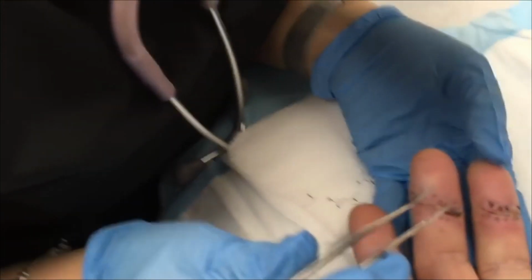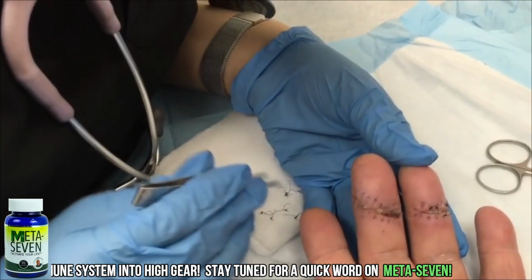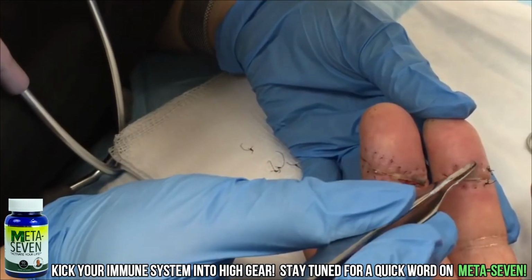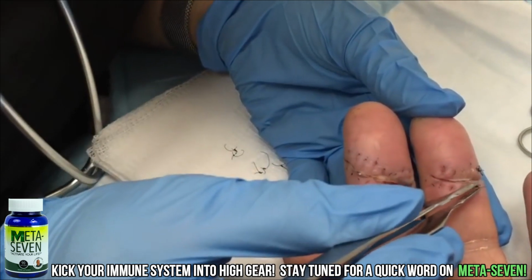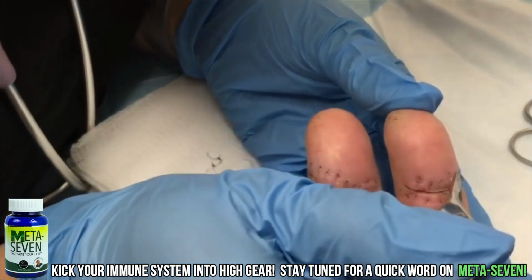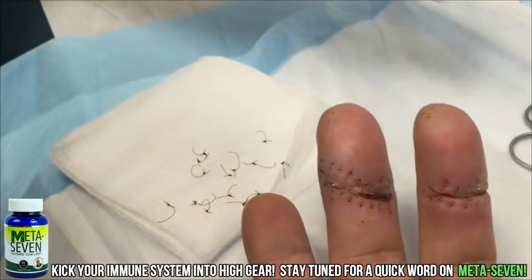I was trying to move my hand. This one opened up the wound. That's okay, take it out, we'll dress it up. That particular wound is right across the crease of the finger joint there, so that's something that can happen. But underlying, it's okay. And we'll put a bandage on there. You'll do just fine with that. Yeah, it's only been 6 days.